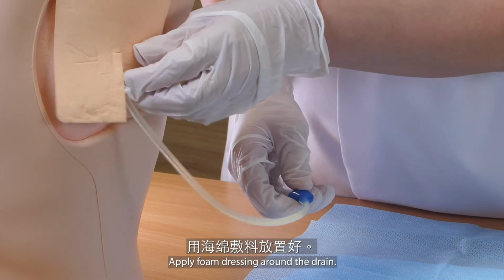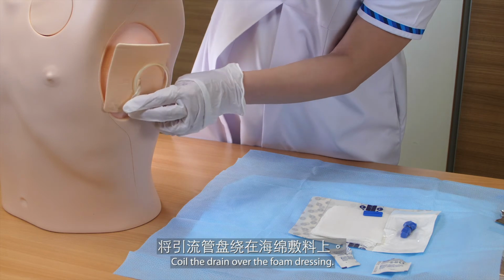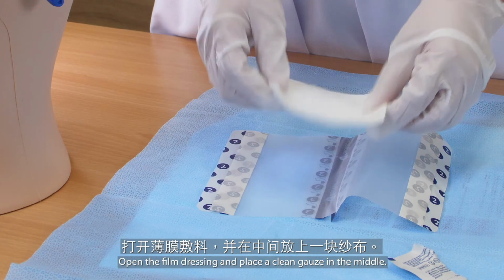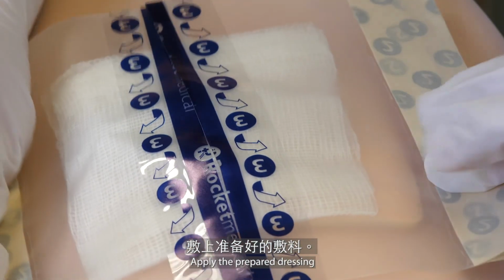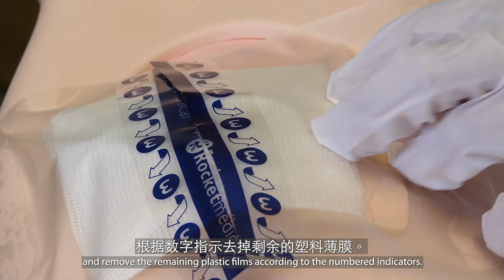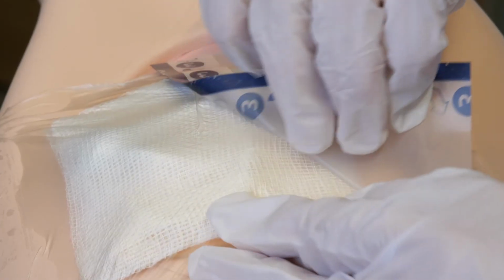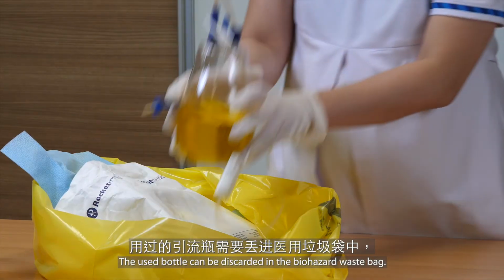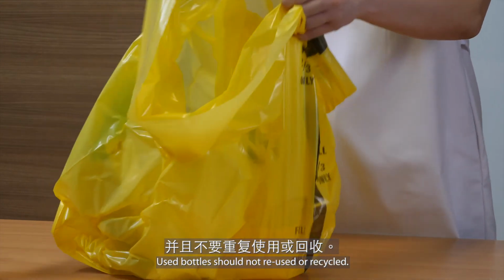Apply foam dressing around the drain. Coil the drain over the foam dressing. Open the film dressing and place a clean gauze in the middle. Apply the prepared dressing and remove the remaining plastic films according to the numbered indicators. The used bottle can be discarded in the biohazard waste bag. Used bottles should not be reused or recycled.